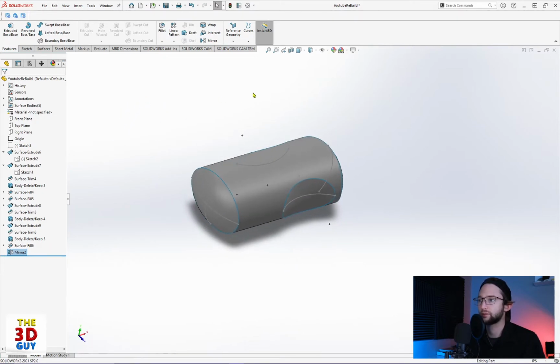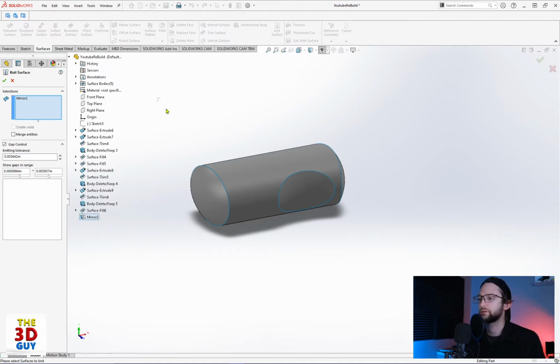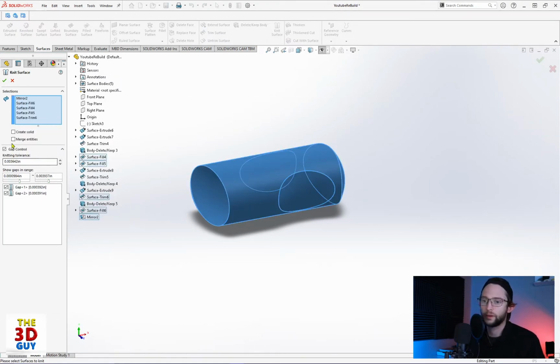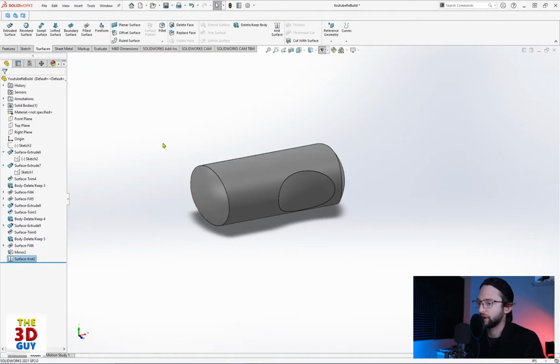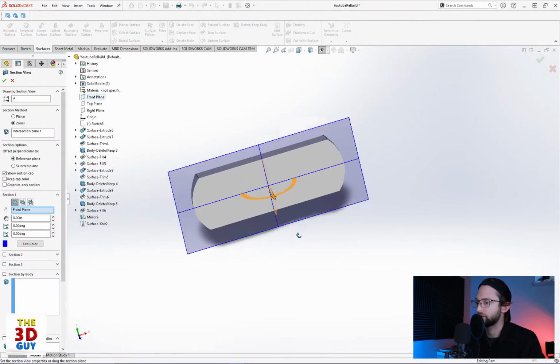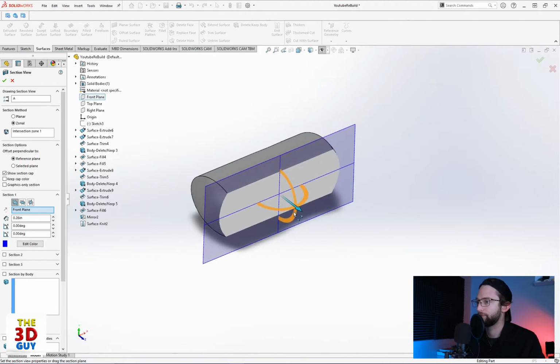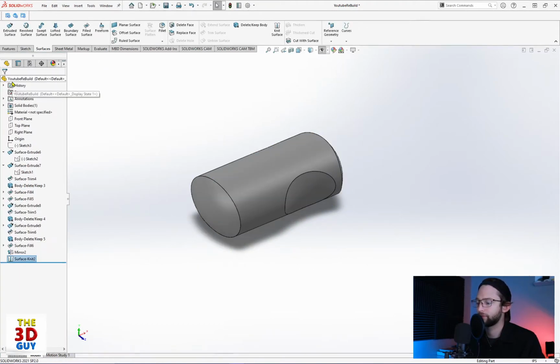Last but not least, let's turn off all the sketches so we don't have to see them. You can see the blue lines saying that they're all separate surfaces. Go to surface, we're going to knit surface, highlight it all. And we're going to merge entities as well as create solid, make it one solid part. And you can see those blue lines disappear, they turn to black. And if we do a cross-section view, you can see it's an actual solid part. So that's it for SolidWorks.